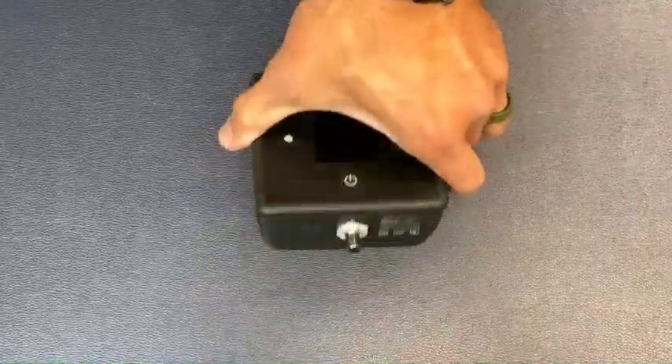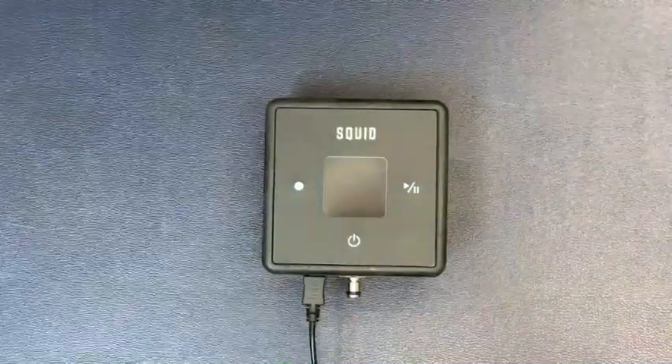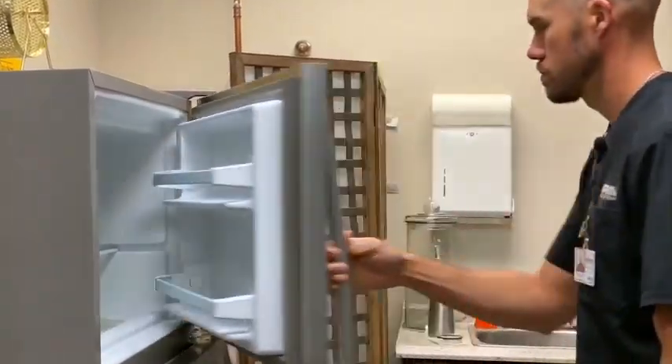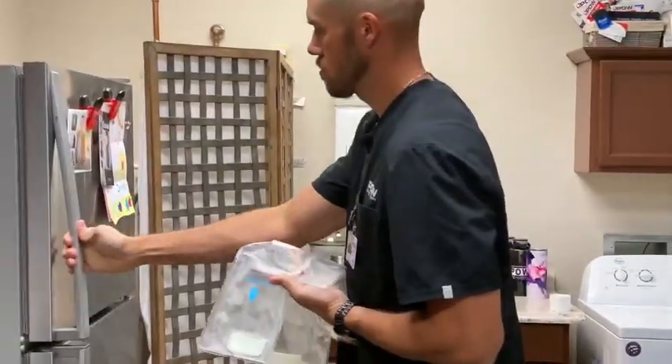Before using the Squid Go for the first time, you will need to charge the control unit using the provided charger. Let the unit charge for about eight hours or overnight. Before using the gel pack for the first time, place it in the freezer overnight. After the initial treatment, place the gel pack back in the freezer for one hour between treatments.